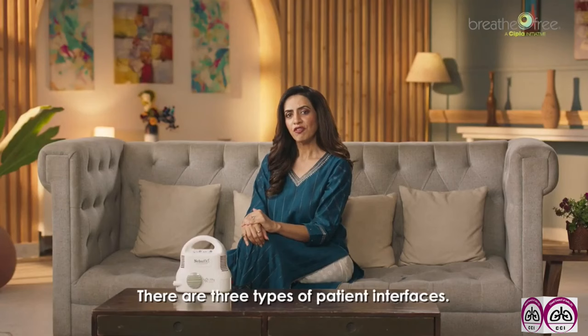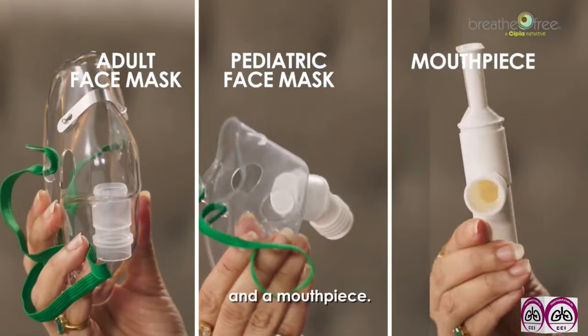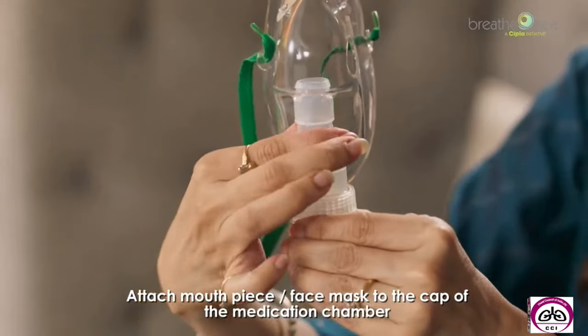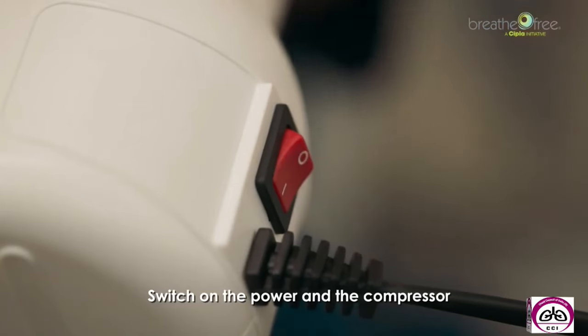There are three types of patient interfaces: adult face mask, pediatric face mask, and a mouthpiece. Attach the face mask to the cap of the medication chamber and connect the tubing at the bottom of the medication chamber. Switch on the power and the compressor.